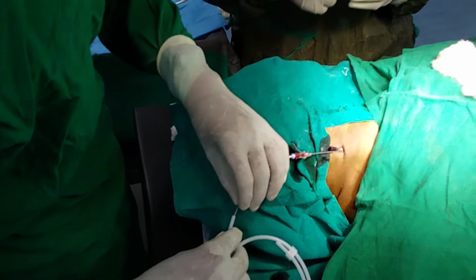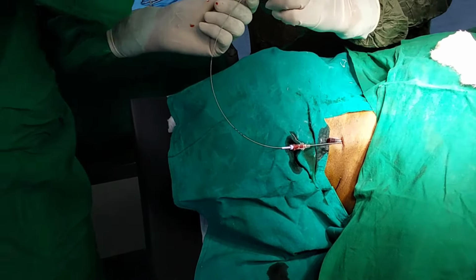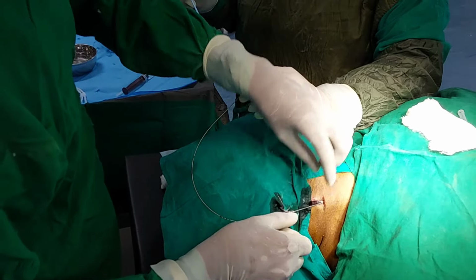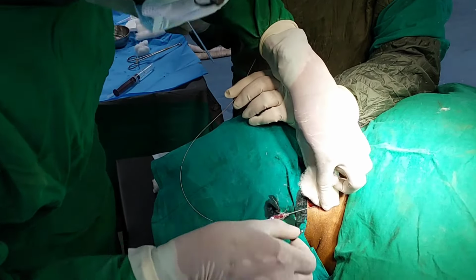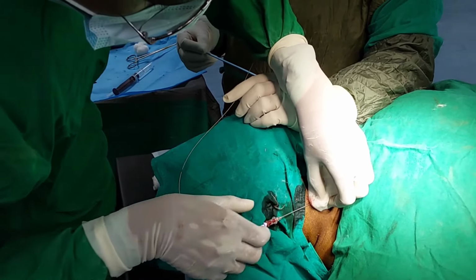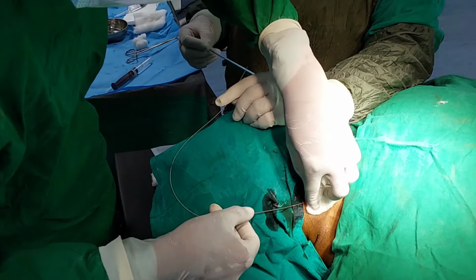Remove the introducer needle while keeping the guide wire in position, and pass the small size dilator sheath through the guide wire and take a small nick with the help of an 11 number blade. Then pass the large size dilator sheath, and remember it should be inserted by rotating movements, not by pressure.